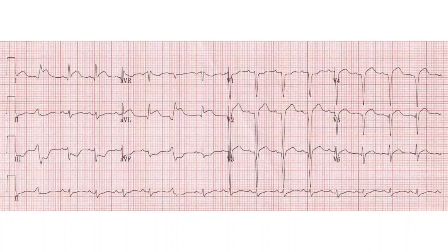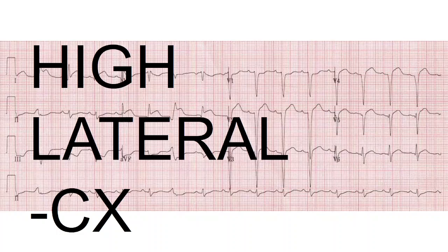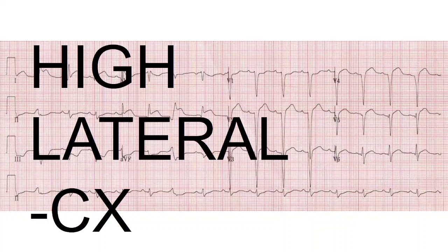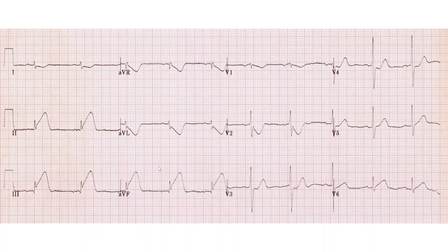This is a high lateral — another easy win as we break into this. If you follow the cursor in leads one and AVL, there is absolutely ST segment elevation. And you can see in three and AVF beautiful ST segment depression — everything we need to confirm there's a blocked coronary artery. If you don't fully understand the vasculature, I encourage you to go back to the understanding 12-lead series. A left circumflex blockage is usually involved when you see this pattern.